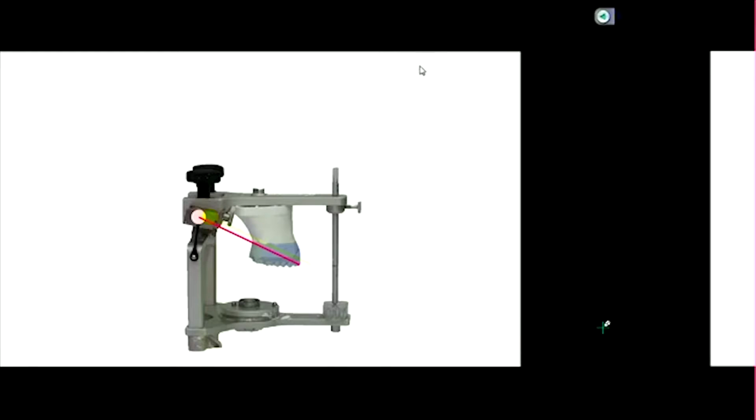Okay, so with that face bow, you can see we've captured the distance from the hinge axis to the incisal edge. You can think of it that way. From the frontal plane, you can see from the condyles to, let's pick the midline, we'll have that orientation or that information captured. So let's say your patient's midline is deviated 5 millimeters to the right side from their facial midline. If you draw a line in between the two condyles, their midline is 5 millimeters to the right side.